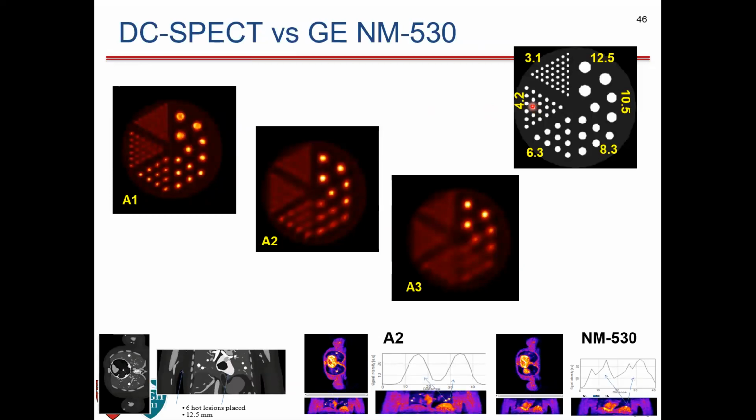The conventional PET can resolve 4 mm rods. Okay, conventional SPECT can do about 10 mm to 15 mm rods, not 4 mm. So if everything goes well within the next few years, then there is a chance that there will be a new system that can provide both resolution and high sensitivity.